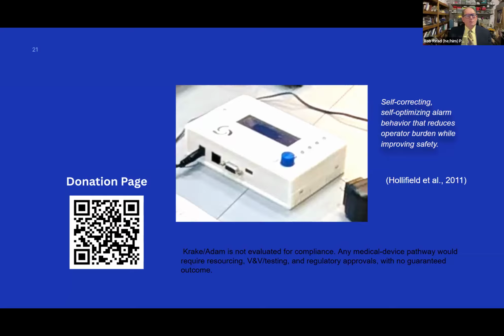The one exception is that there usually are not alarms on what are called transport ventilators, used when someone is being transported in an ambulance from a first aid situation to a hospital. Those ventilators often don't have alarms. But a hospital-based, ICU-based ventilator always has alarms.